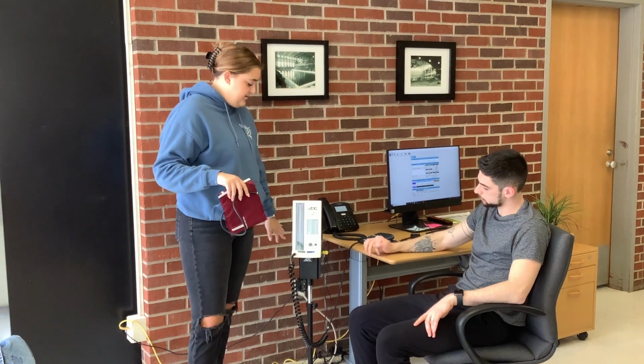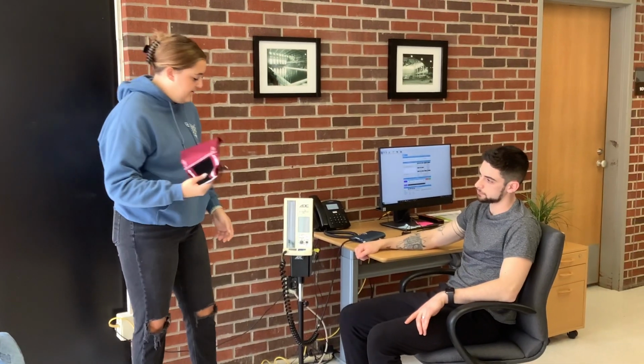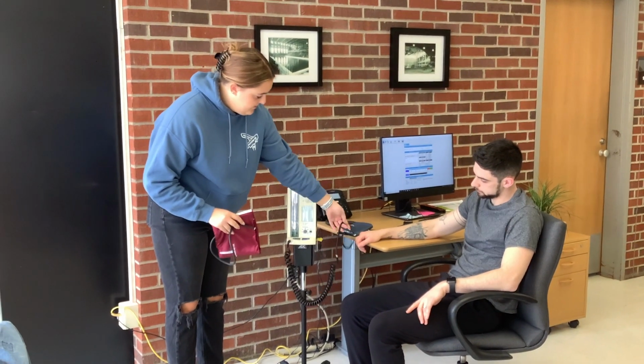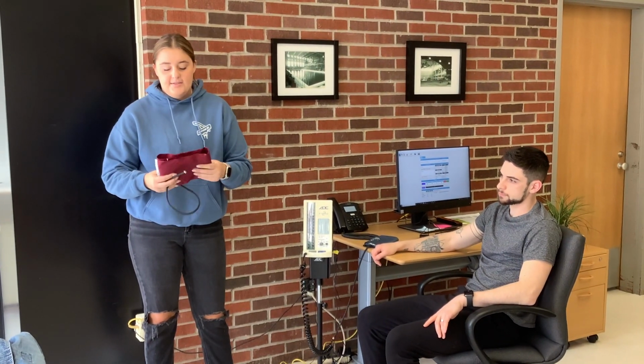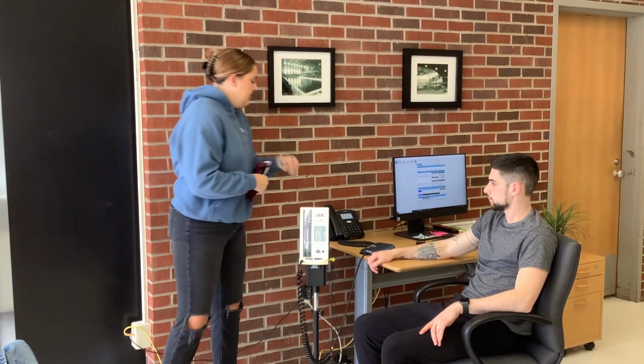You want to make sure it's plugged into the wall. And I usually have this cuff connected here. The way that you connect it is you can screw and unscrew right there. But for Ryan, we're going to use the smaller one. I just like to keep the larger one plugged into it because we'll have larger participants come in and I'd rather have to go down on a blood pressure cuff than go up while they're here.